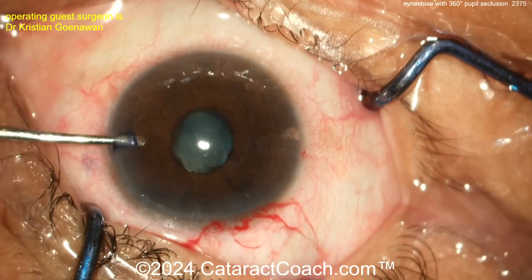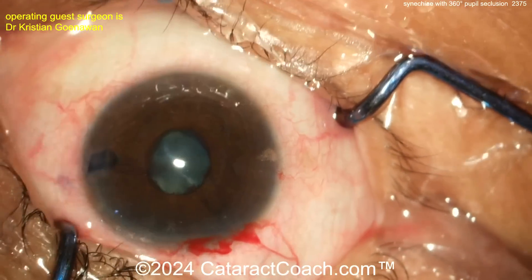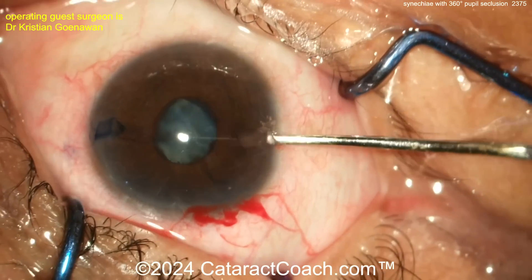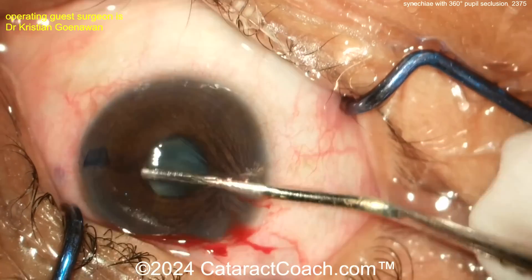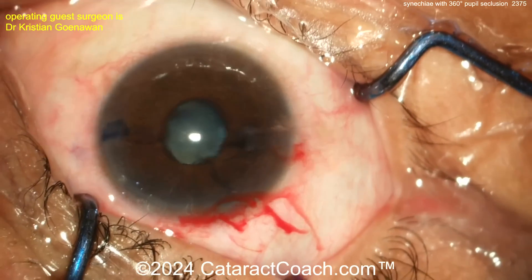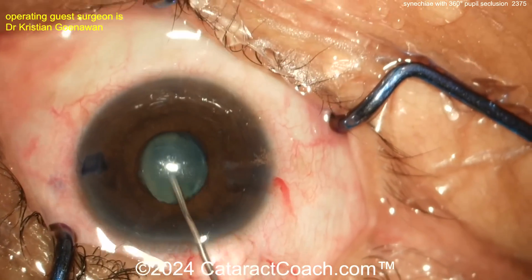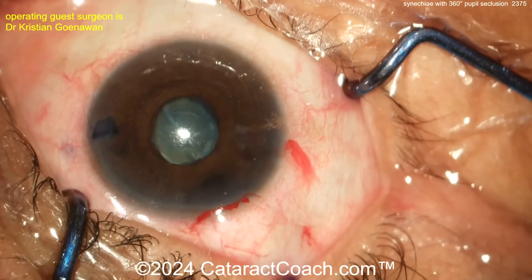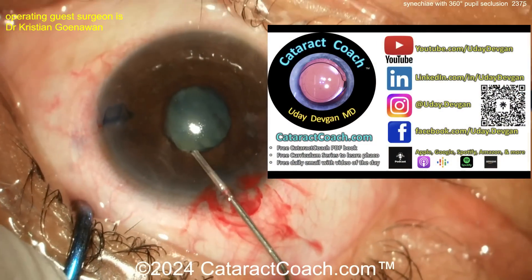More viscoelastic from the other direction — don't trap too much under the iris or it will shallow the anterior chamber even more. Get good synechiae lysis, break up all those adhesions, and then perform some sort of pupil expansion. Most people here would put in iris hooks, which is a very reasonable choice.